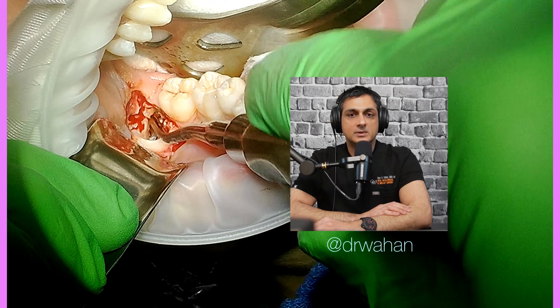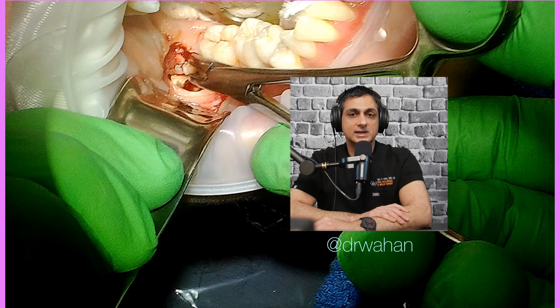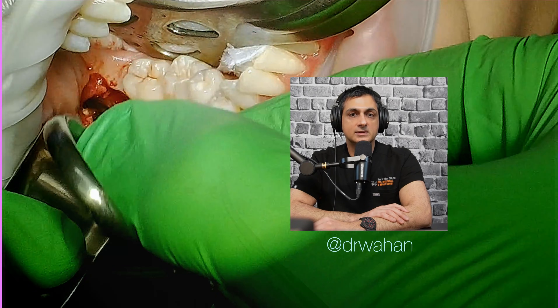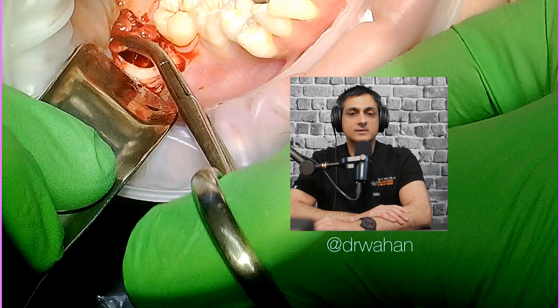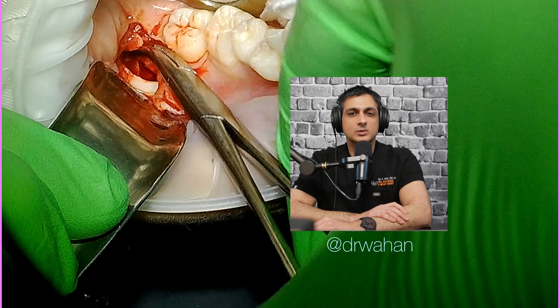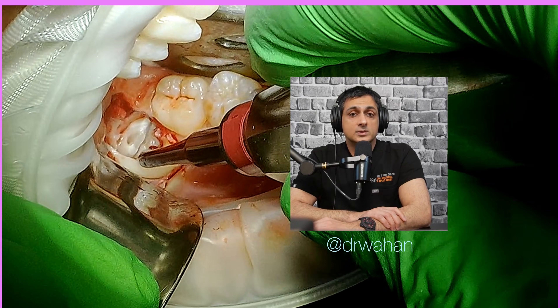I split the tooth and immediately heard it — it didn't split all the roots, which I didn't expect, but it had that hollow, snappy sound. I'm taking out the distal piece of the crown in little segments, which is normal for something like this. And here is most of the cystic lining — this is the dentigerous cyst I'm removing now. That's the dark stuff you saw on the x-ray.